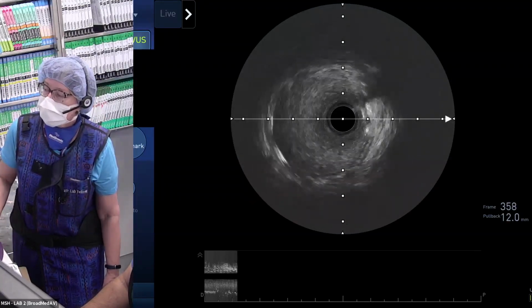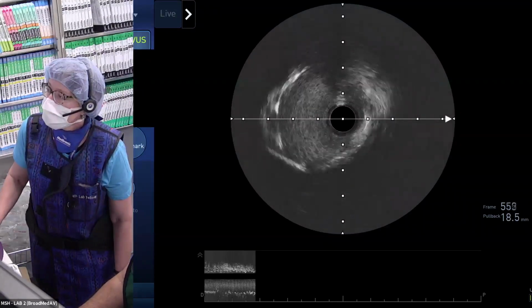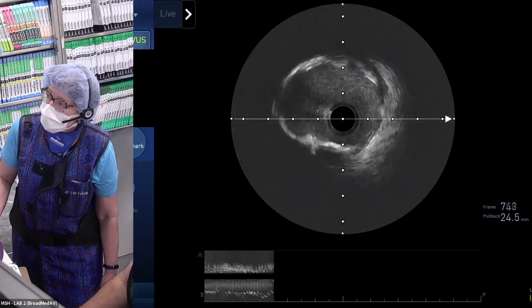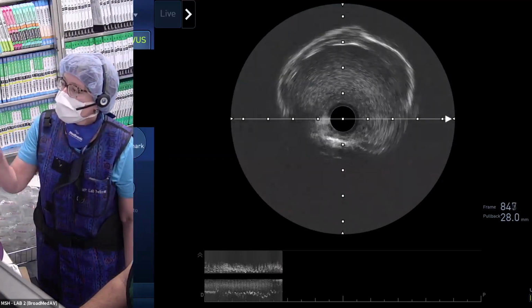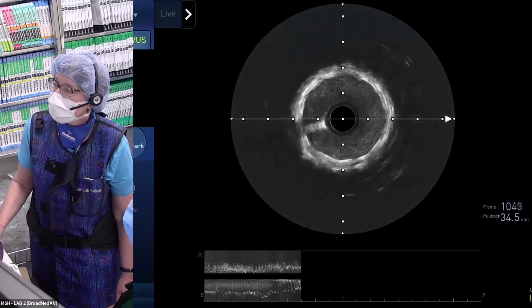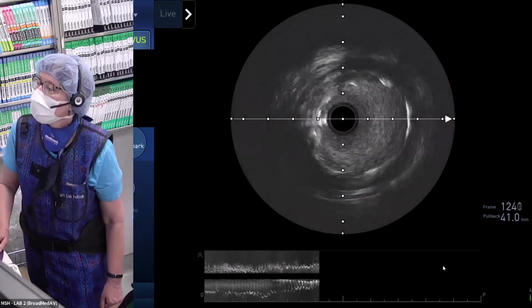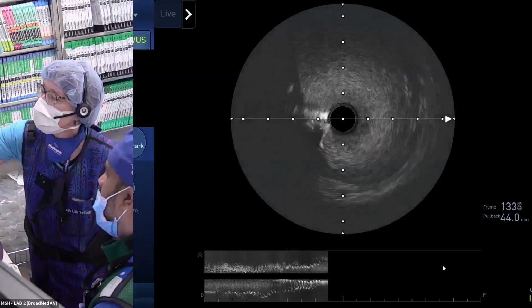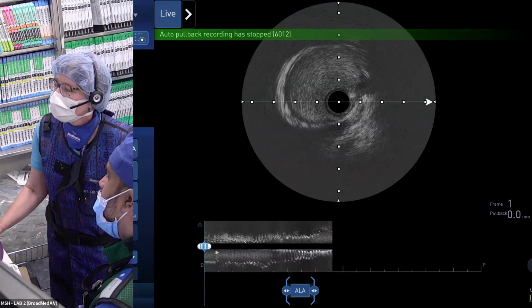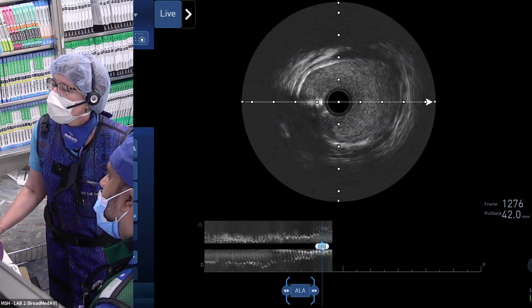Now we start seeing the stent. Distal edge is good. No dissection. Not malapposed, fully opposed. Good expansion around calcium. Nice expansion. What about the level of the diagonal? Right there, now we are at the level of the diagonal. But proximally also, you see that? Well opposed. Proximal edge, there's a little bit. At 11 o'clock you see some malapposition. But one strut length is okay. It's allowed. Now let's take a picture. This is calcium.